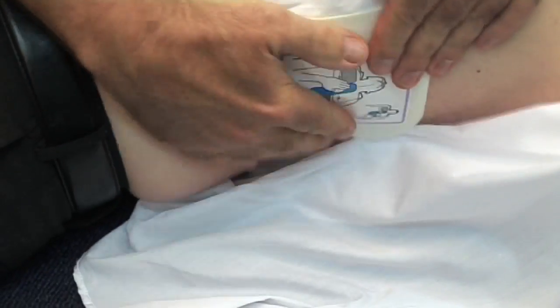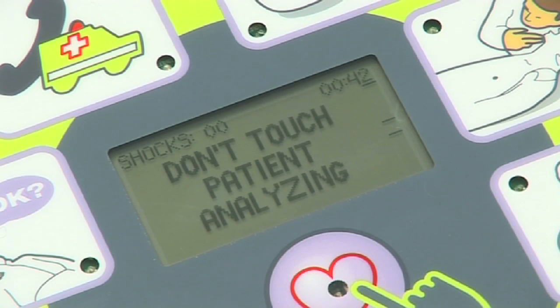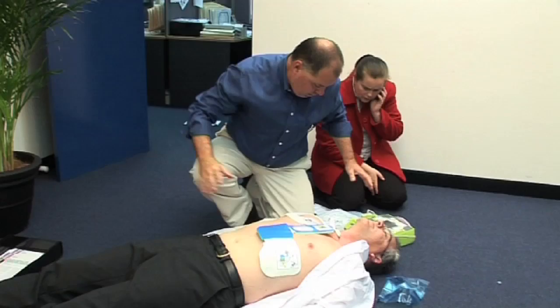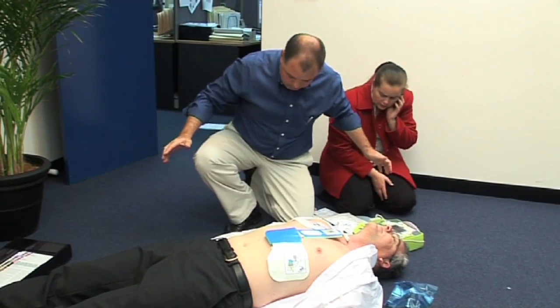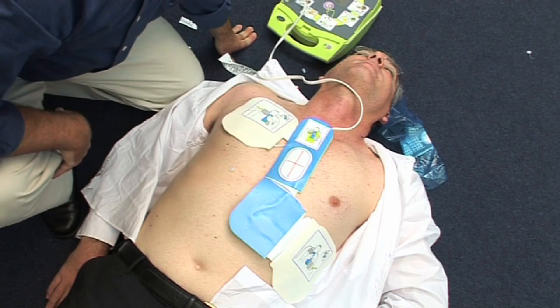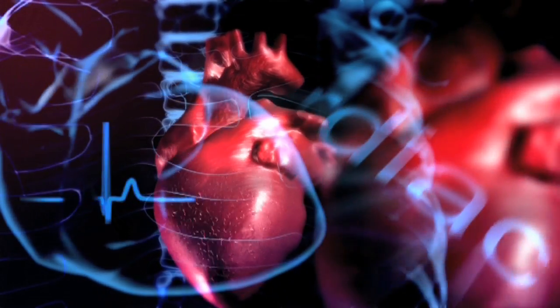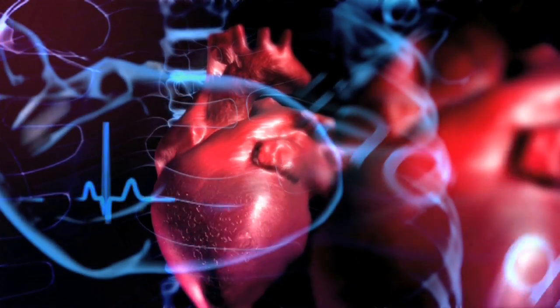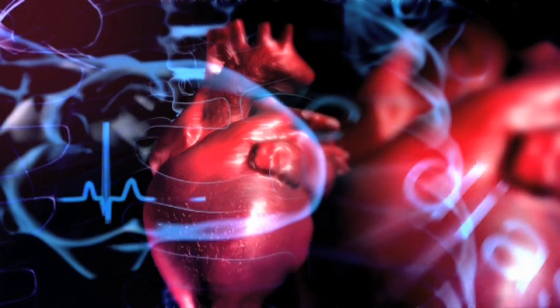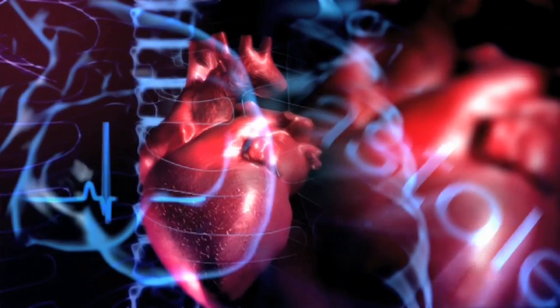The AED Plus will now assess the state of the patient's heart. Don't touch the patient. Analyzing. A shock is required when the heart is beating irregularly and sufficient oxygenated blood is not being pumped to the vital organs such as the heart and brain. Defibrillation stuns the heart briefly, stopping this irregular rhythm in the hope that the heart's internal pacemaker will reset the heart into an effective organised rhythm.